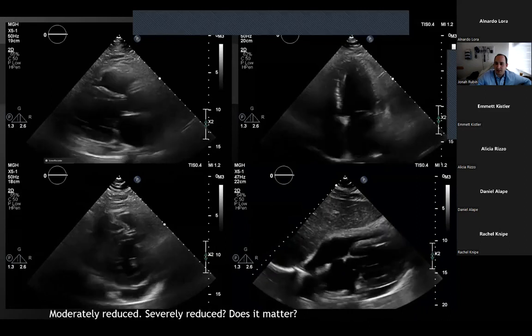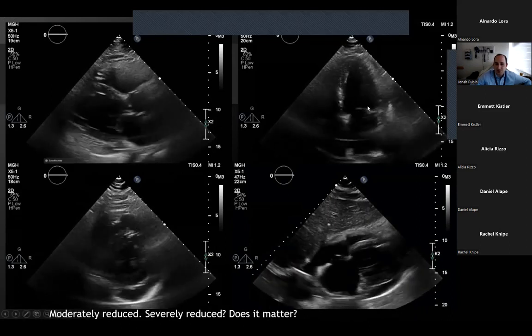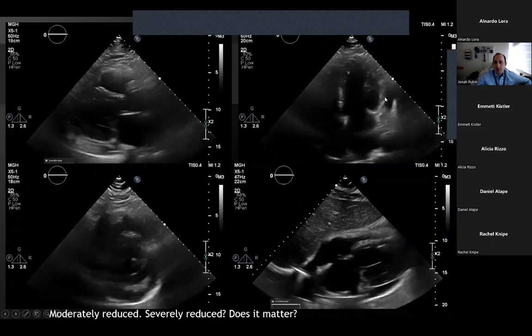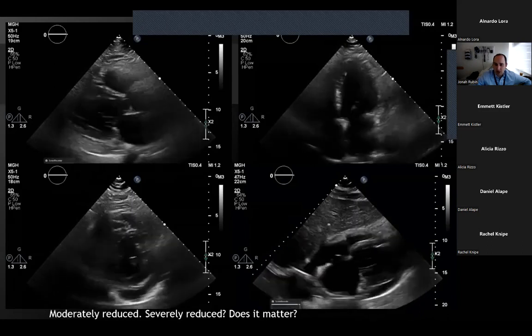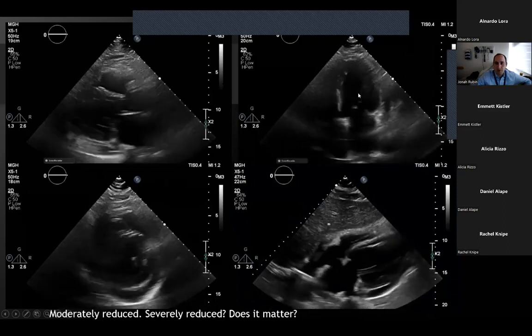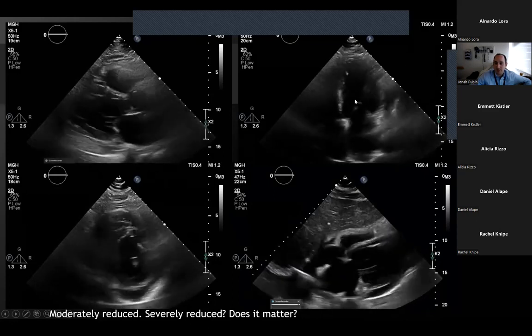if you think that this is clinically significant, which is a good opportunity to mention that it's very important in interpreting any LV function, like any other imaging technique, to know the baseline. A patient could have an underlying reduced EF and come in shock, and this could be their normal heart, right? So if yesterday they were pumping away with an EF of 60 and they have no history of heart failure and you're seeing this, this is your answer.